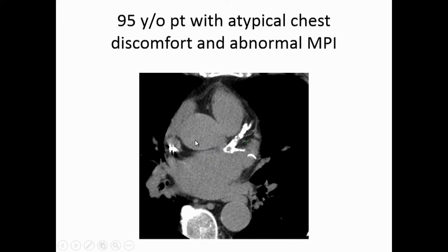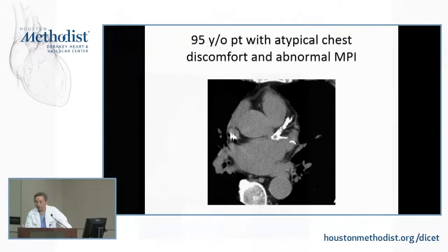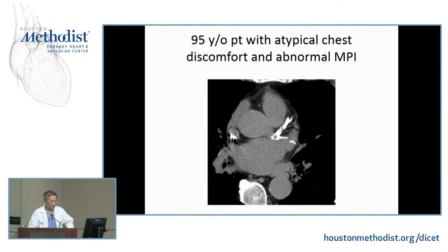This is a case that we just did a week ago. A referral from a Memorial Hermann cardiologist in West Houston. He referred this patient, 95 years old, with some atypical chest pain and an abnormal stress test. Calcium score 2,300. Actually, the patient wasn't scanned here, which I called him about this morning. I said, if you have a patient like this in the future, you might want to send the patient here. So the patient ended up at Methodist West Houston, where we have a 64-slice scanner.